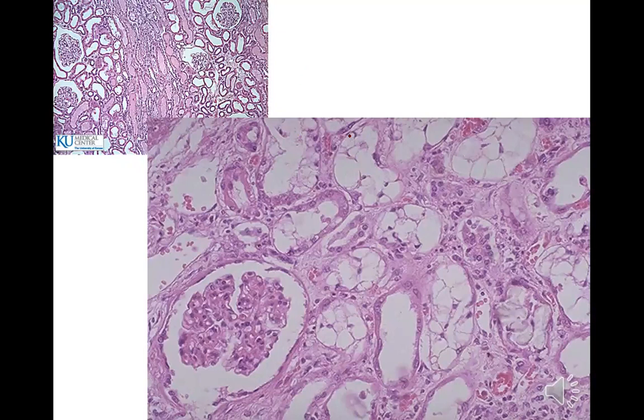I think this is a little better picture of acute tubular necrosis. You can see how those cells are kind of obliterated. Look at the normal glomerulus though, right? So the blood vessels are okay, but the problem's in the urine, or the filtrate, I should say, I'm sorry. This is normal. Top left is normal, like we saw before.